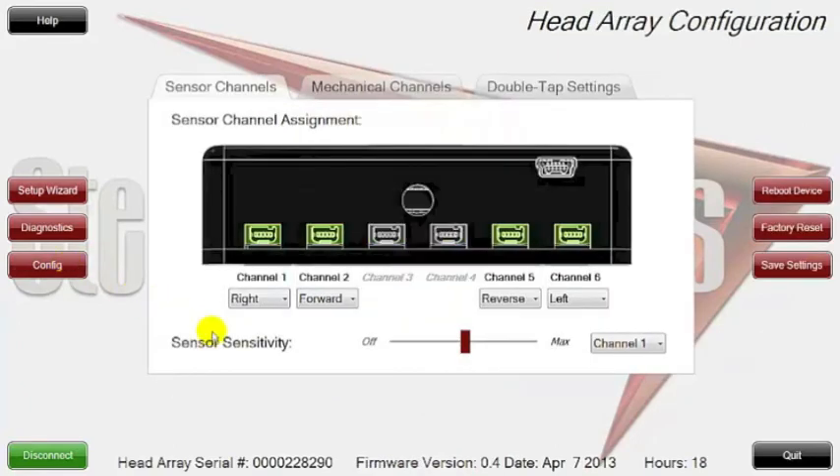We're in the configuration mode. The first thing I want to point out is that you're able to see all the ports and how they're all assigned and configured. You'll see that channel 1 is a right command, channel 2 is a forward command, and channels 5 and 6 are set up for reverse and left.